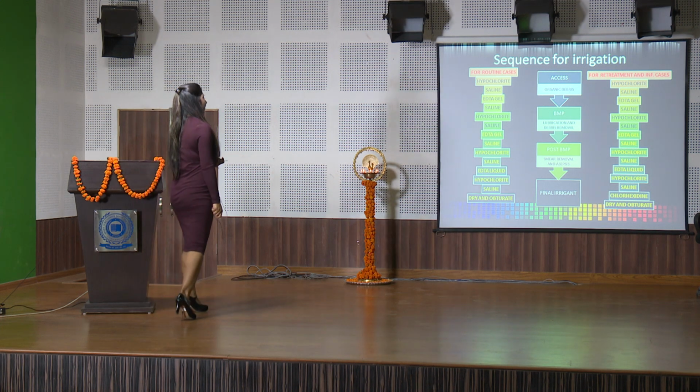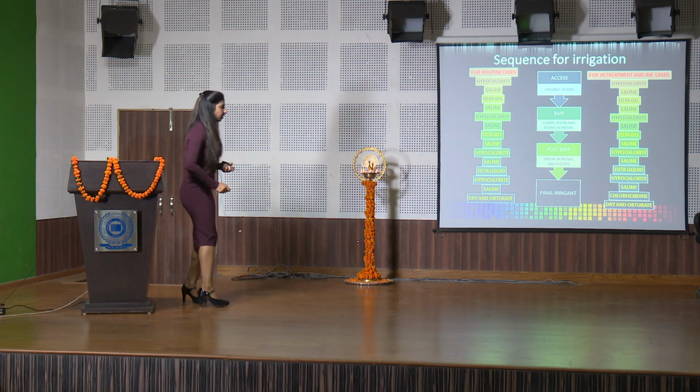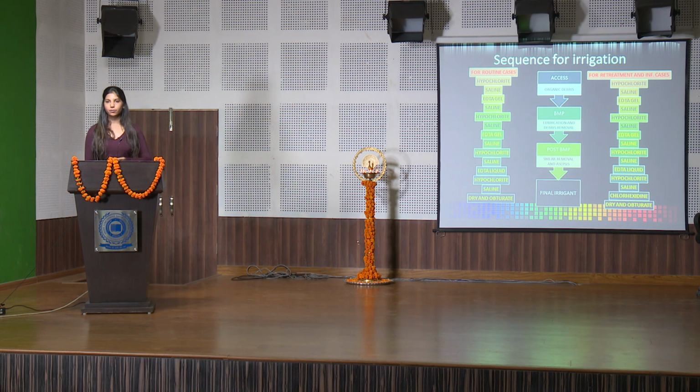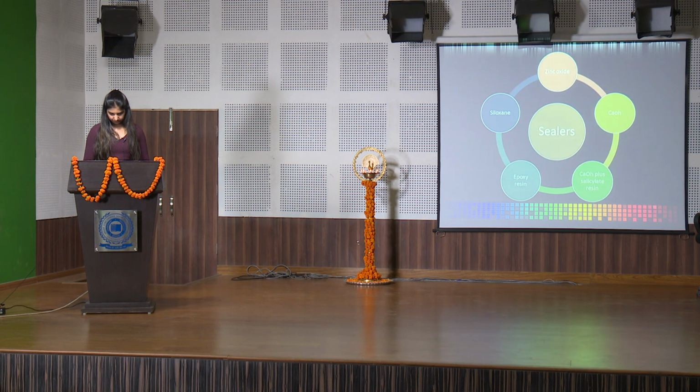Remember to use a 17% EDTA liquid before you obturate, because that will take care of the smear layer that you have created with your rotary instrumentation. Finally, dry the canals and obturate.